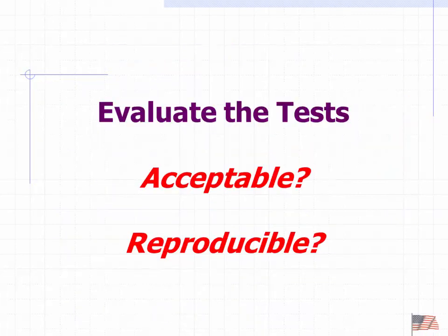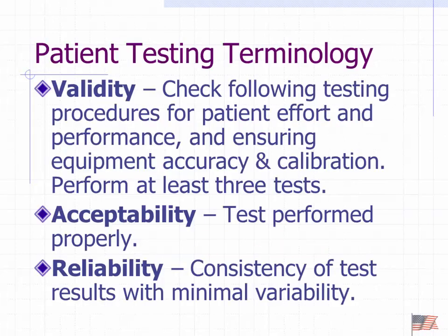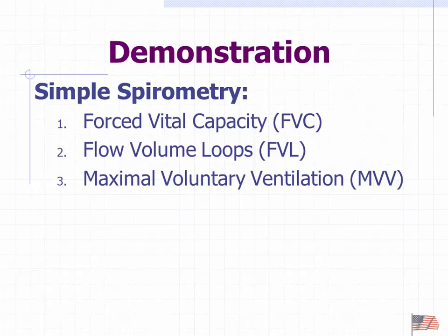And then we're going to evaluate: is it acceptable? Was the test done correctly? And is it reproducible? So again, we verify validity by making sure the equipment is properly calibrated and doing 3 tests. It's acceptable if the test is done correctly, and it's reliable if the results are consistent with minimal variability.